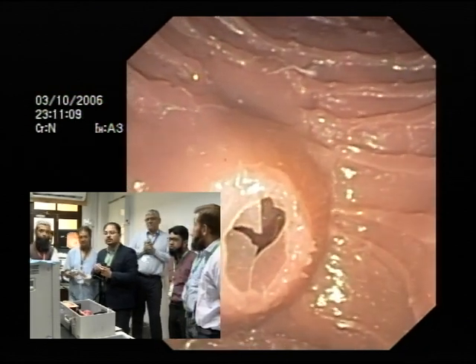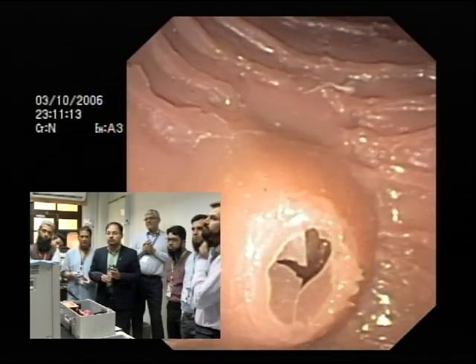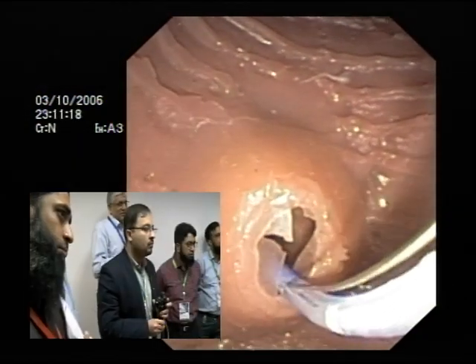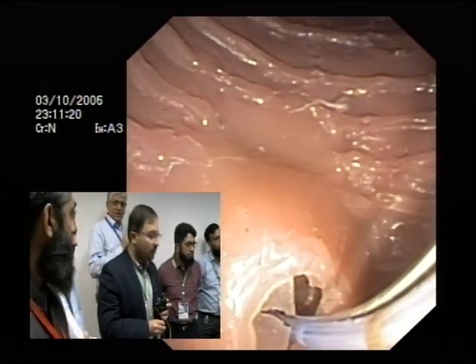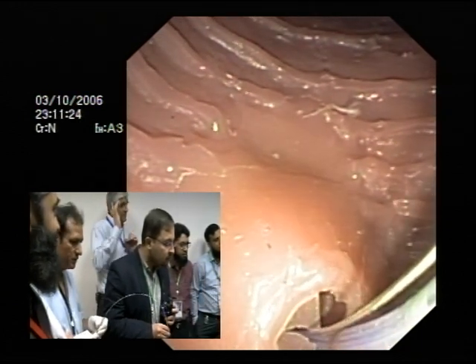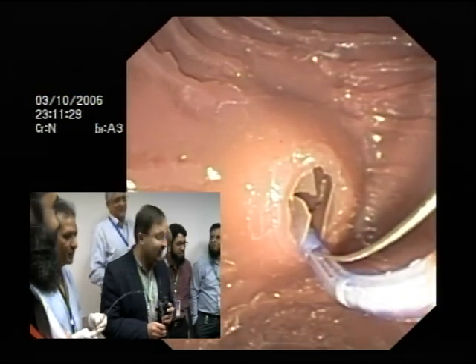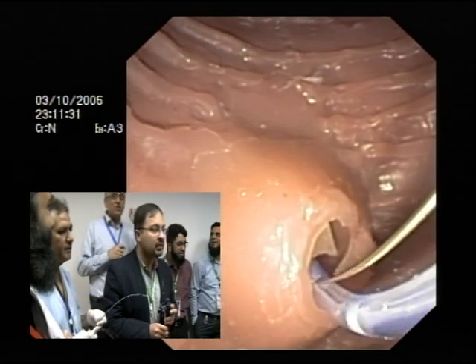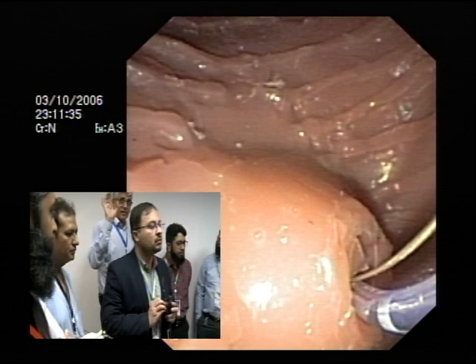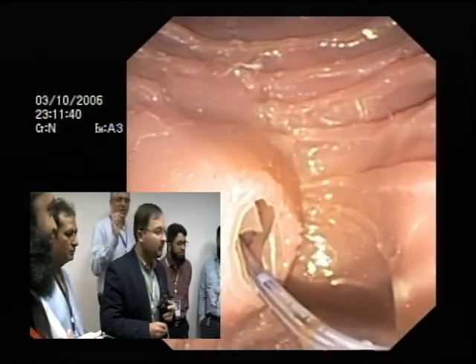Doctor, so what do you do? I go with the wire. Occasionally I'll try the wire first. In my practice, the ampulla that's winking at me worries me. Unless it's actually squirting bile, that's different. But if it's just winking, a tiny opening which is telling you, I'm waiting here for you, come in, it means it will not allow you to come in.